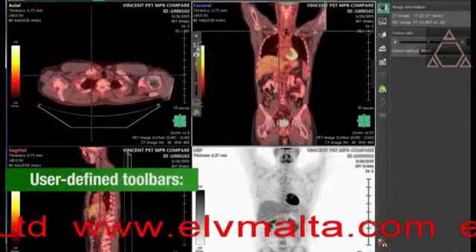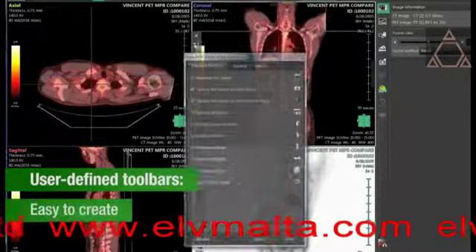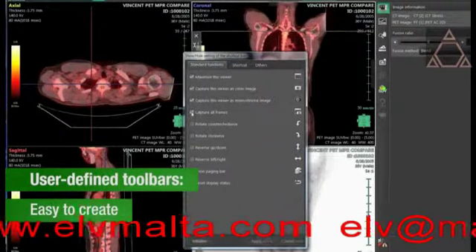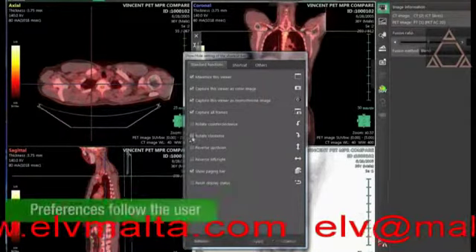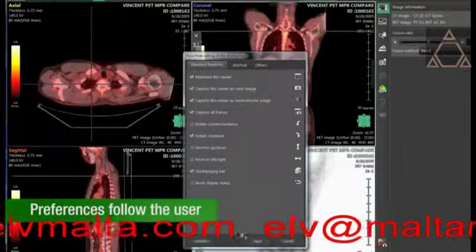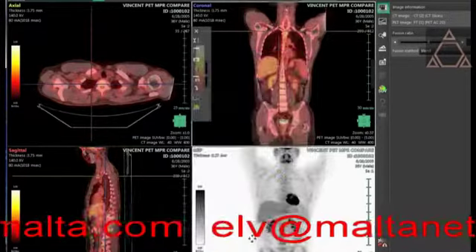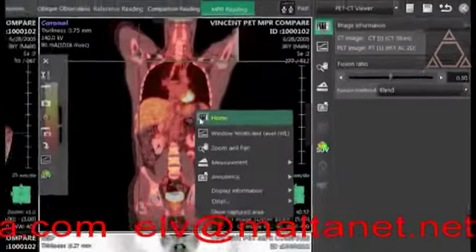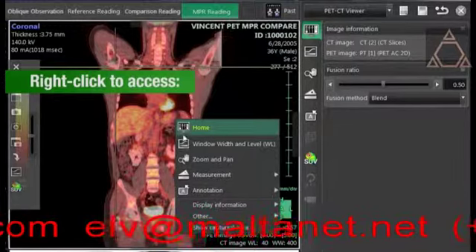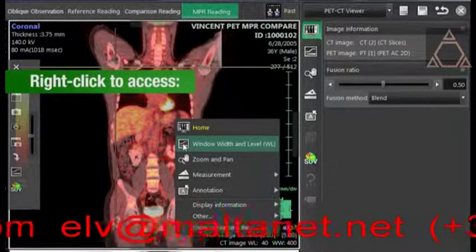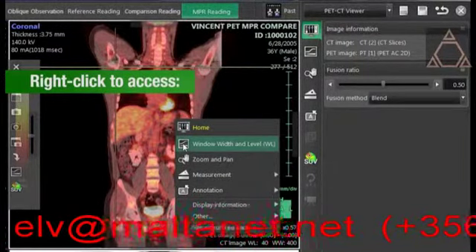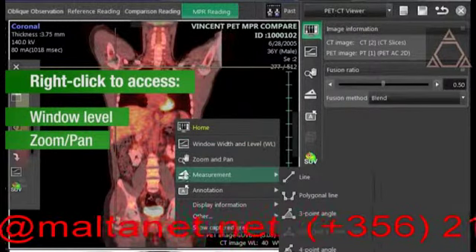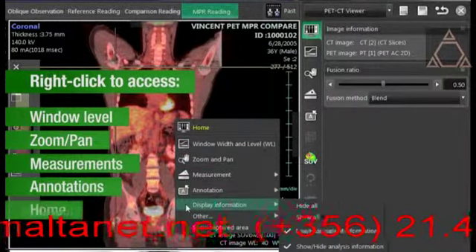User-defined toolbars let you create a tool layout by selecting the functions that match your needs. Once defined, your customized layouts will follow you to any Synapse workstation. In any Synapse 3D application, right-click lets you access common functions without performing multiple steps — including window level, zoom, pan, measurements and annotations, or home.